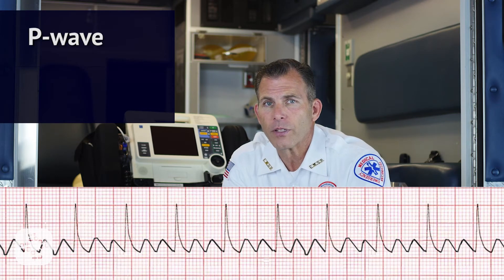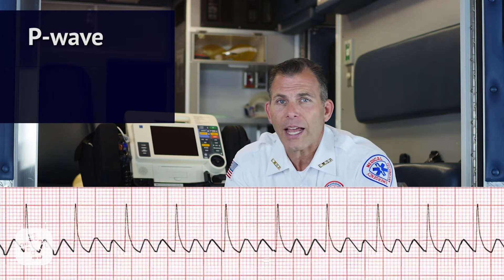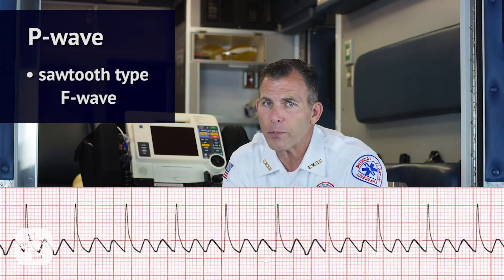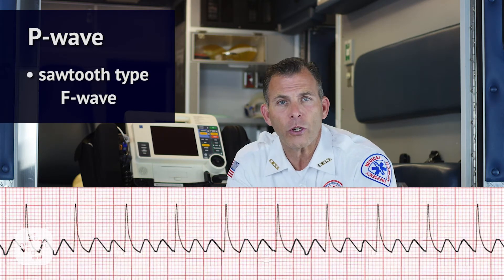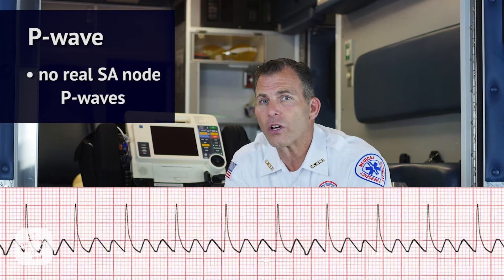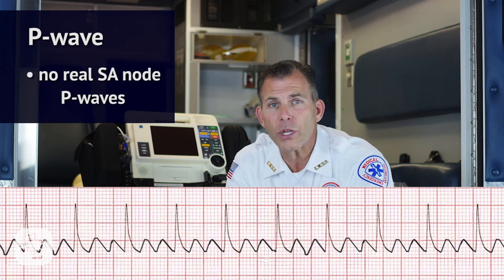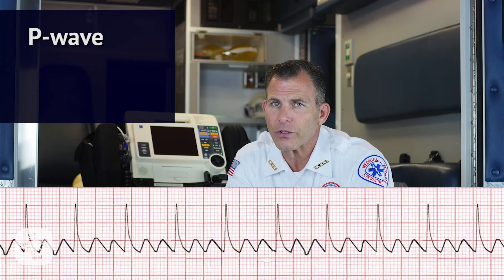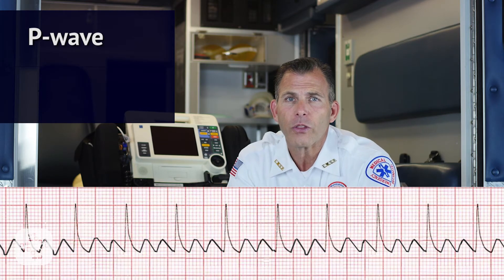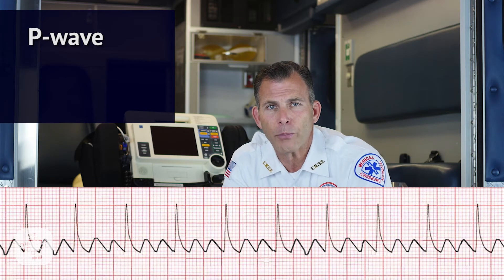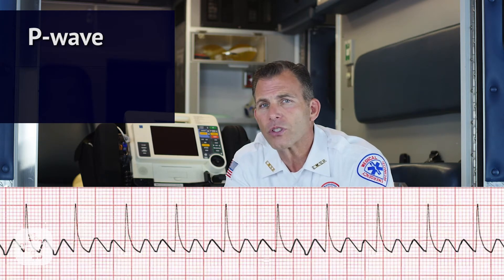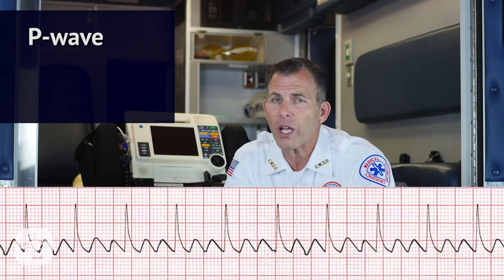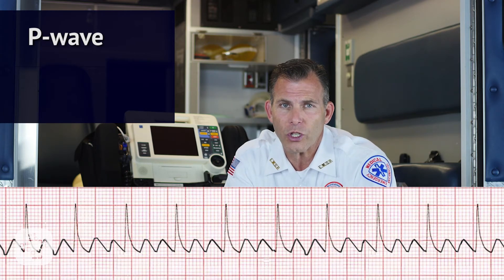Next, let's evaluate the P wave. Are they present? Anything closely resembling a P wave is actually a sawtooth-type F wave. Do they occur regularly? No, because there are no real SA node P waves. Is there one P wave for each QRS complex? Again, no. There's no P wave for each QRS complex. Are the P waves smooth, rounded, and upright? That doesn't apply because they are sawtooth in shape.